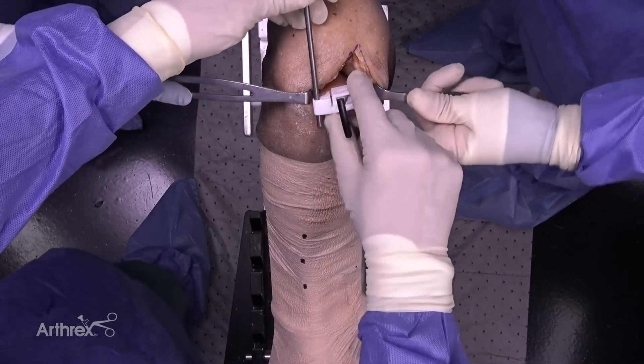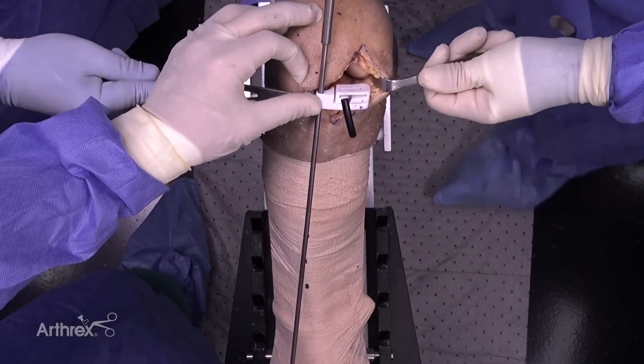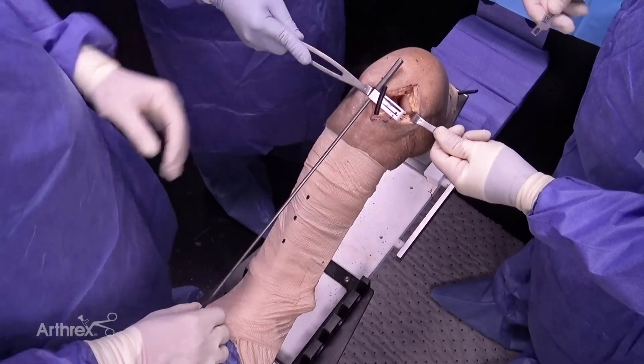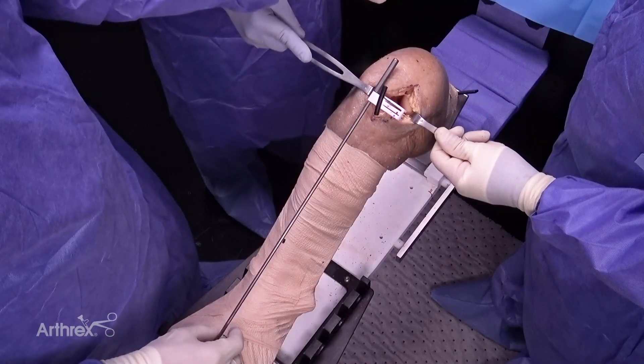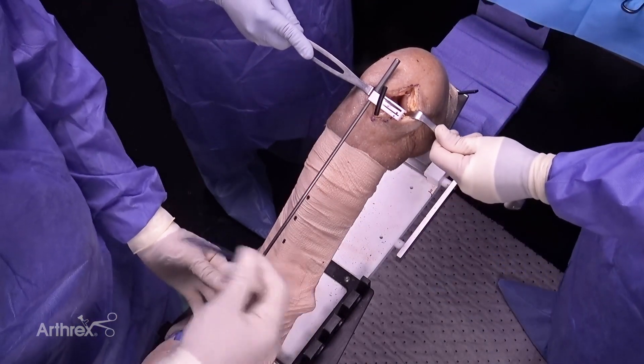In order to determine our varus-valgus positioning, I drop a drop rod through the cutting guide. I'm trying to line this up and make it parallel with the marks I made on my anterior tibial crest. The last thing I need to do with the guide is set my medial-lateral position and rotation.